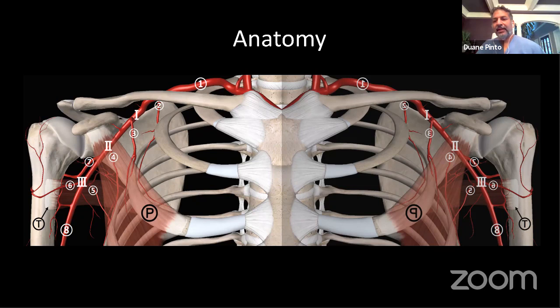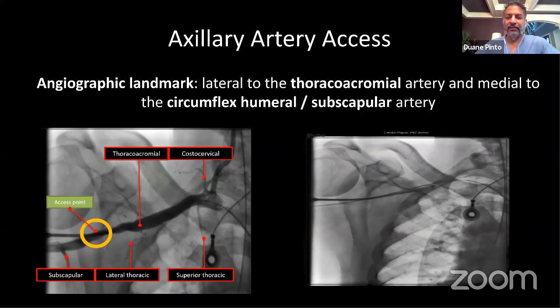So in the last couple of minutes, I'd like to describe axillary access, not because you should go out and do this today, but because it re-emphasizes almost all of the techniques that we described just now for large bore access. And until you have mastered those techniques, you shouldn't attempt axillary access. But when you have, this becomes a very valuable tool.